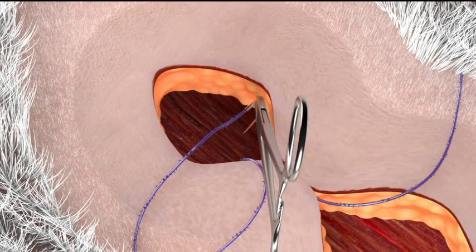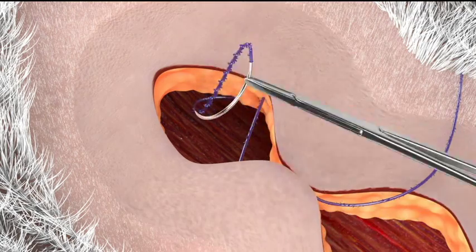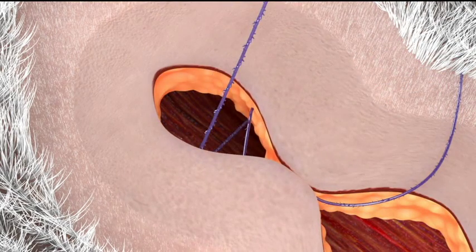You then proceed with the closure by running one arm of the quill device in a simple running fashion through the same tissue plane. You will notice the even distribution of tension with this technique.